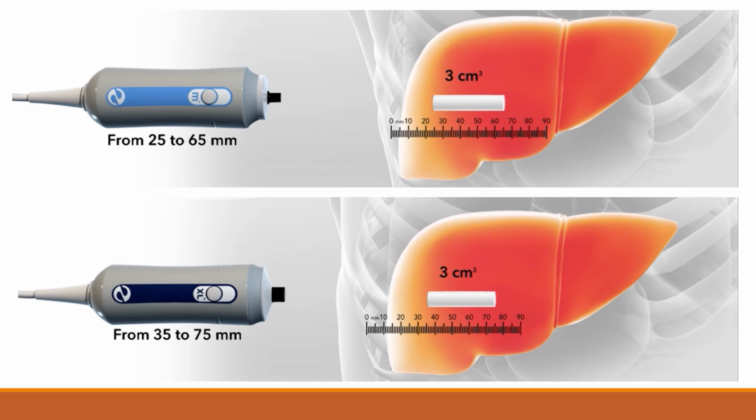So with higher levels of obesity, the deeper the probe needs to induce and follow the shear wave. Now, the introduction of the XL probe has significantly helped to overcome this limitation without really sacrificing diagnostic performance. Sometimes though, even if a patient has a relatively low BMI, their anatomy may just not be conducive to the exam. For example, someone who has a very narrow intercostal space.